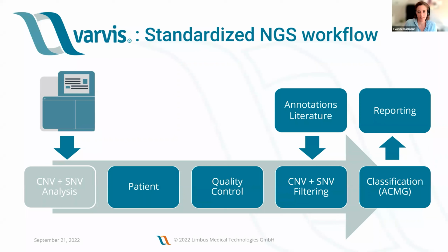So when the data is in varvis, the standardized workflow looks a bit like this. We have the sequencer and the CNV and SNV analysis that are performed basically in our system. So this is not your task in this moment anymore. It's been outsourced to varvis.